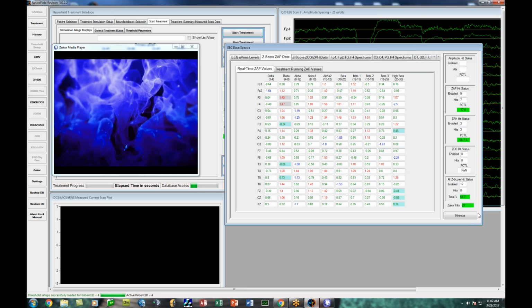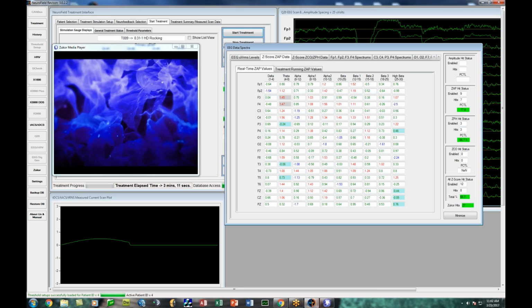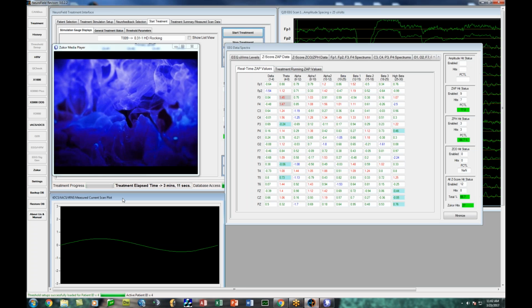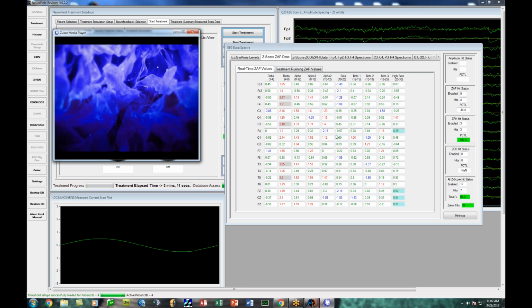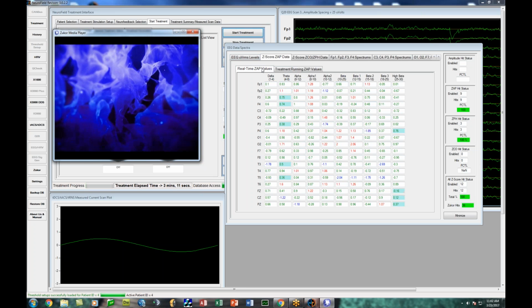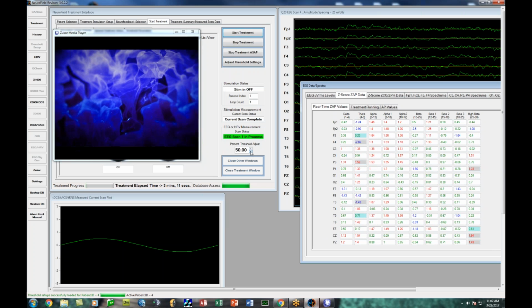On the right side here, you can see the percentage. And here we go, we're at the end of 32 seconds. She's getting her first stim right now. And you can actually see that running here. And after the first stim is over, we go right back into our next training epoch. So she's training along, and we're going to go over here and set our threshold right here.